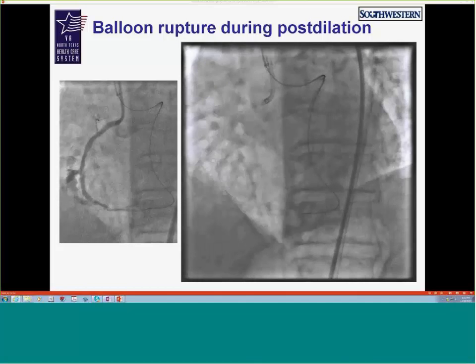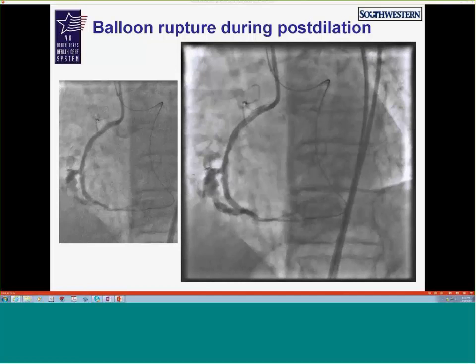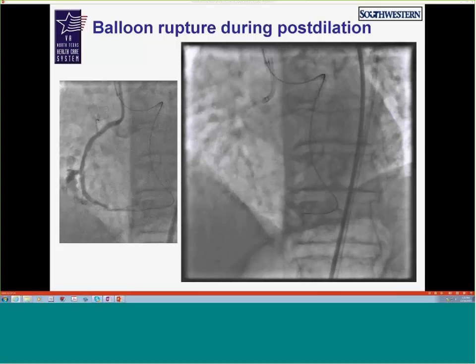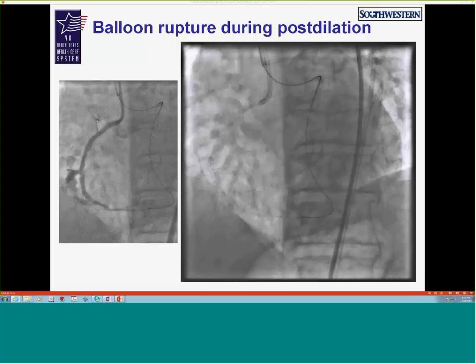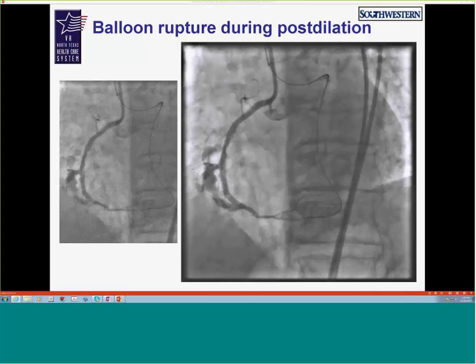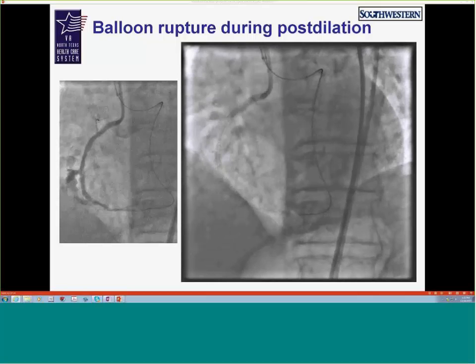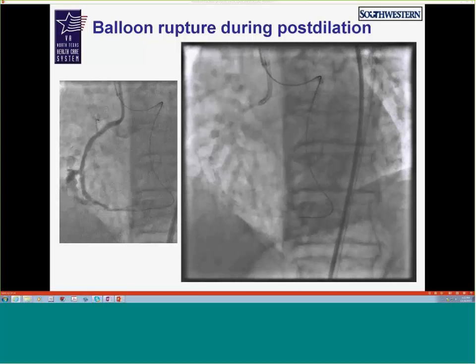Now, the challenge here is that we have externalized wires, so both femoral guides are used as part of the rail. To do this, we would have to get either a brachial and get a big one in, or get a radial. With the new covered stents, 6 French is all you need. You don't need 7 anymore. It's monorail, and they're 6 French up to 4 millimeters in diameter.